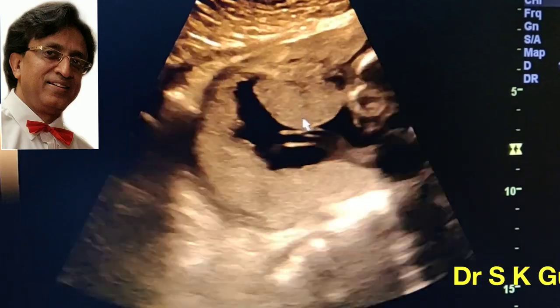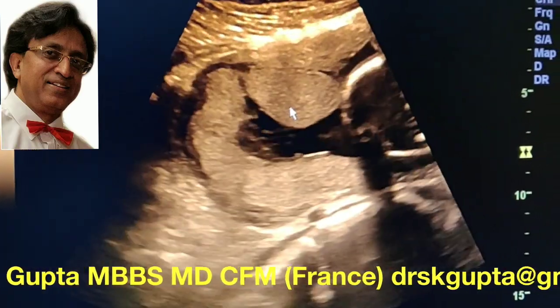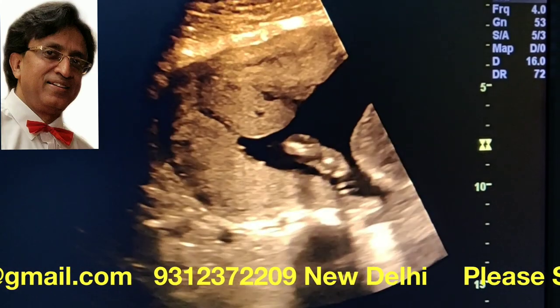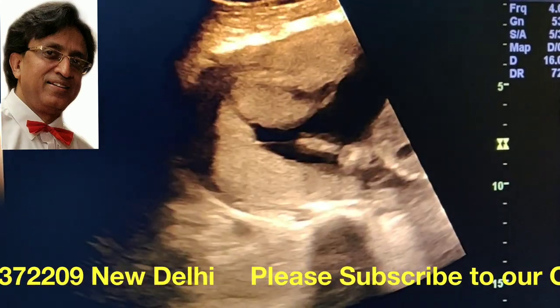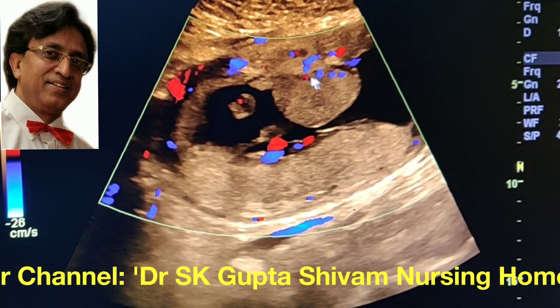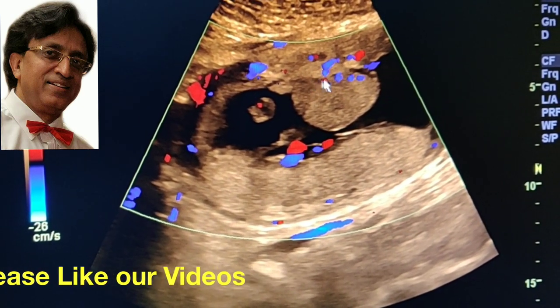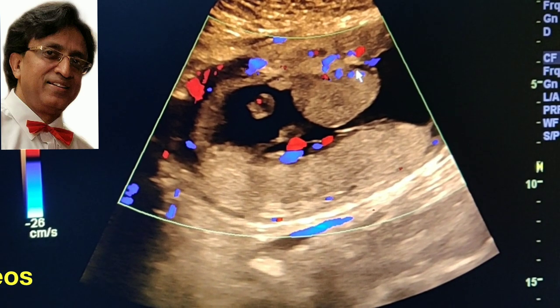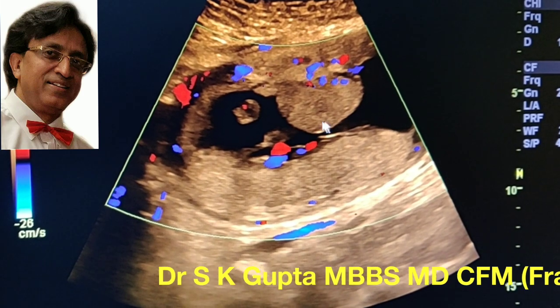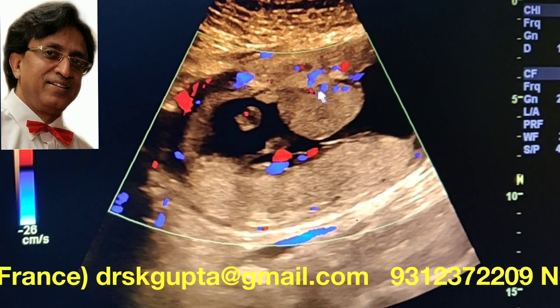Secondly, the succunturiate lobe appears the same in morphology as that of the main placental tissue, while a contraction is likely to appear more hyperechoic. The third and most important differentiating feature is that the succunturiate lobe of the placenta will show a retroplacental space with some blood vessels, as in this case. Here you can see the retroplacental space and the main blood vessels behind this succunturiate lobe, while in cases of uterine contraction these vessels may not be seen.